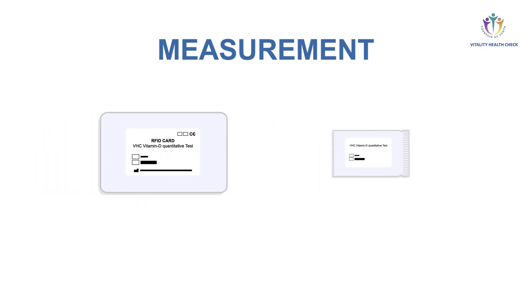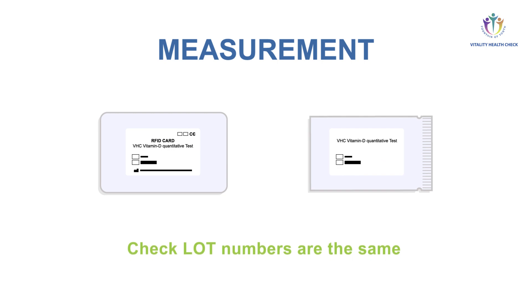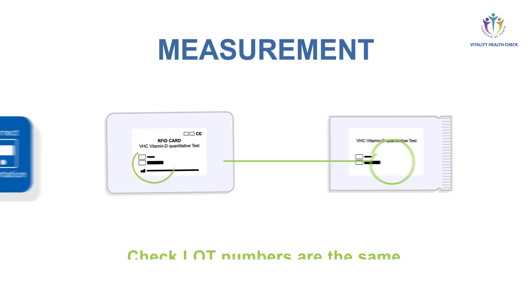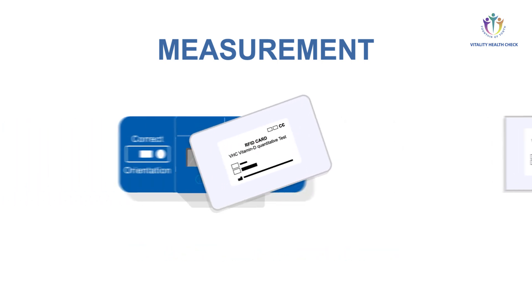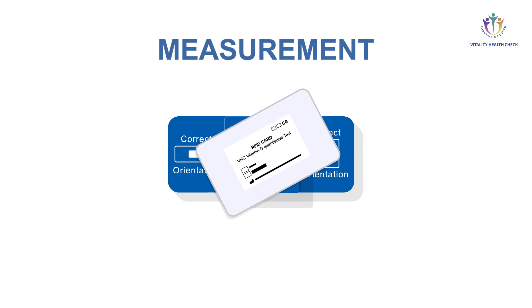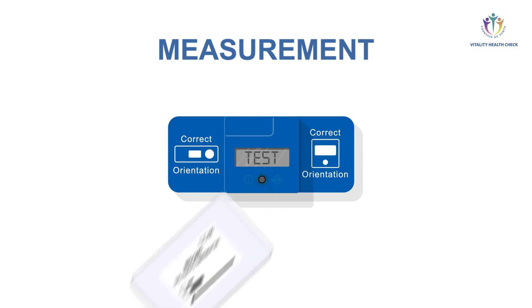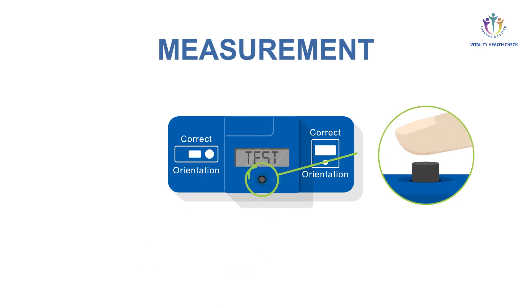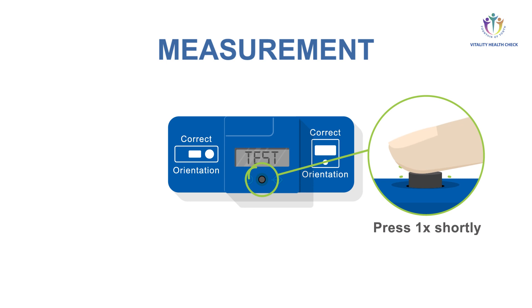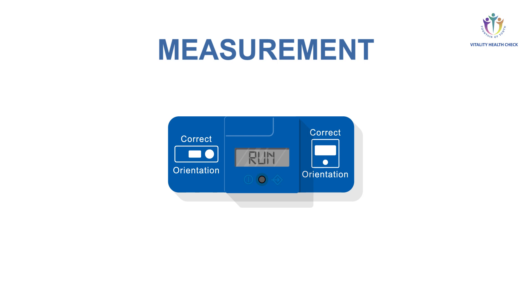Verify the lot numbers of the test packaging and the RFID card are the same. Place the RFID card on top of the VHC reader. A beep tone confirms the data transfer is completed. The display will show test. Press the button again. The 15 minute countdown is shown on the display. At the end of the countdown, the display shows run and the measurement is performed automatically.